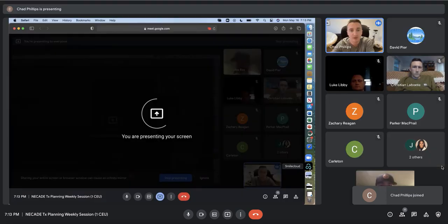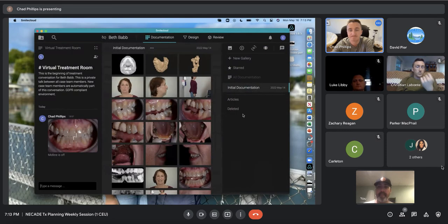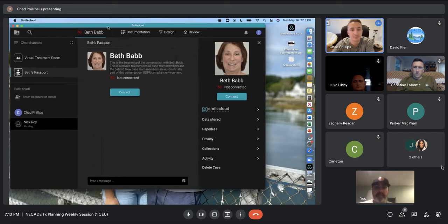So it's called Smile Cloud, and actually one of the two presenters at the course is the co-founder of this program.